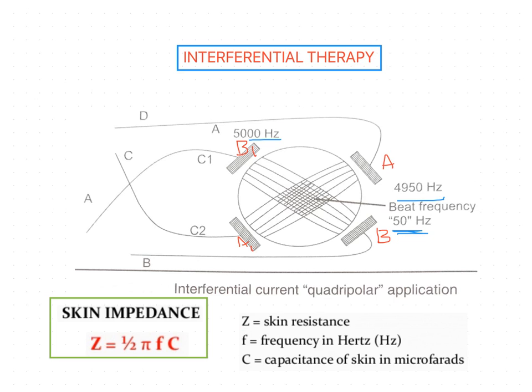One of the currents out of these two circuits is kept constant.